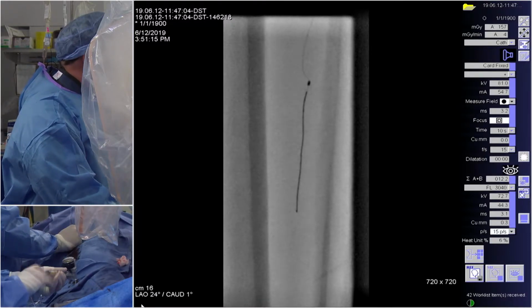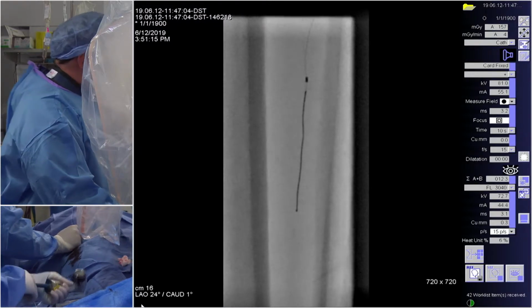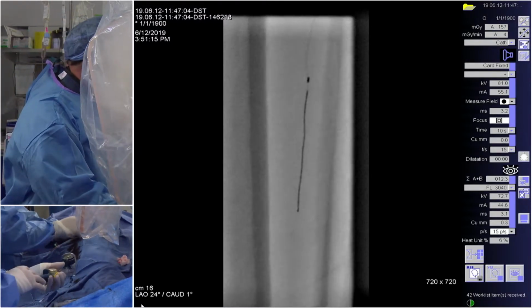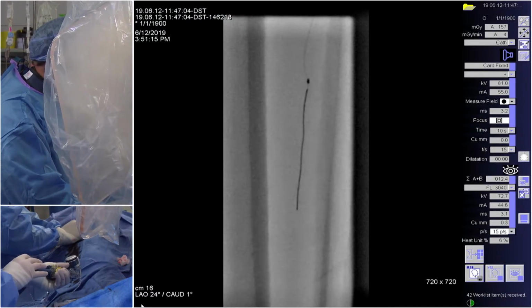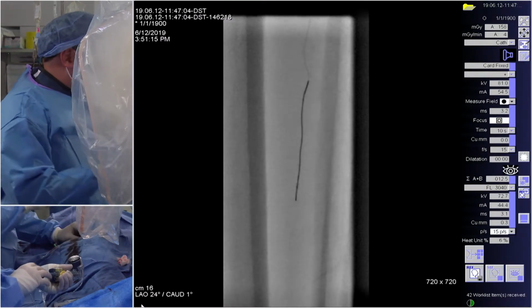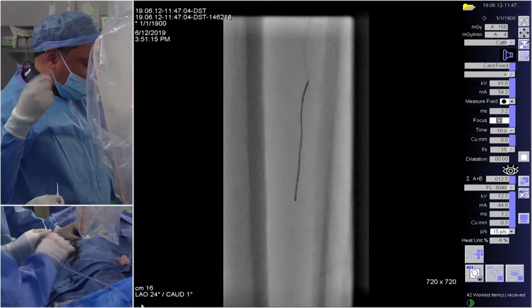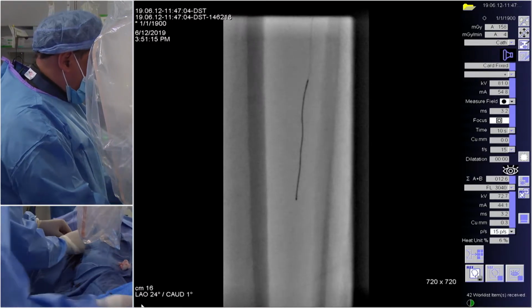If the wire was flip-flopping back and forth, then I would agree that I would be a little bit concerned. So here, just because the wire was kind of smoothly tracking along, I really sort of felt that it's just kind of tracking along the vessel. So this is going to be a real issue here. Can I ask Robert here? Robert, would you consider IVUS before you balloon, or would you not necessarily IVUS?